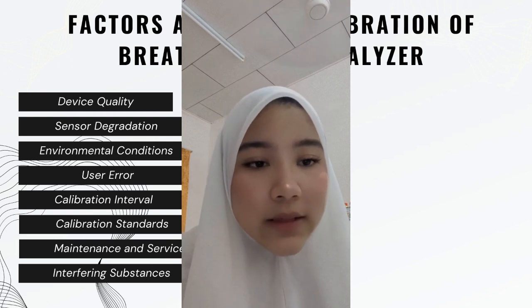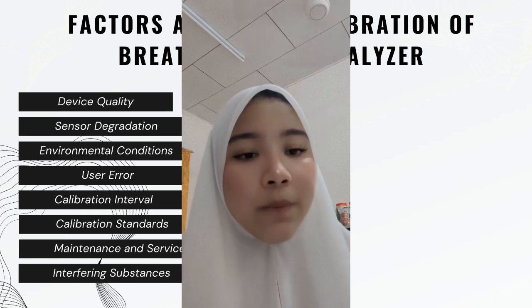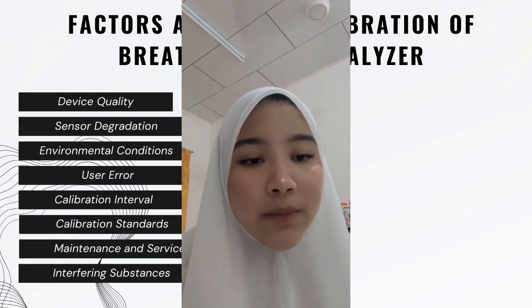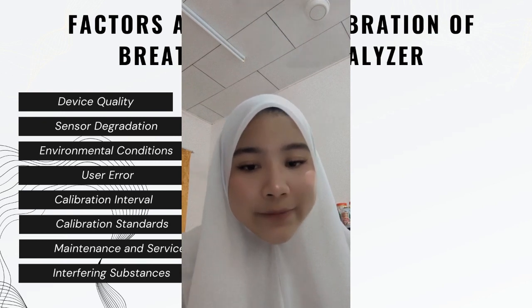Next is maintenance and service. Regular maintenance and servicing of the breath alcohol analyzer are crucial to maintain accurate calibration. The last one is interfering substances. Some substances, such as certain mouthwash, medications, or chemicals can interfere with the accuracy of breath alcohol measurements.